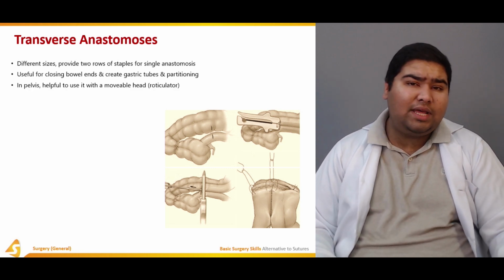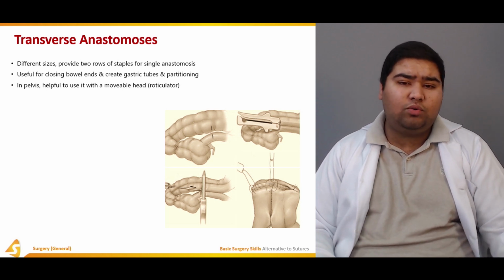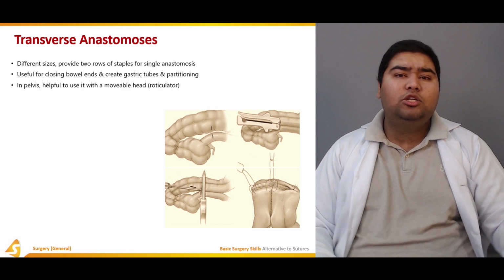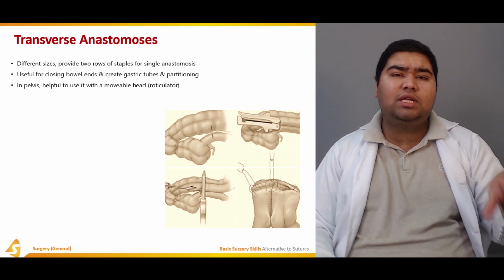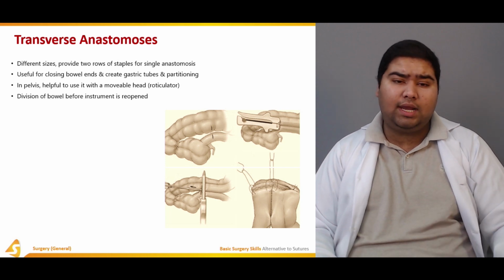Now they're useful in the pelvis, but they have to be used with a movable head, which is known as a roticulator. So a roticulator can be used in the pelvis with the help of a roticulator.